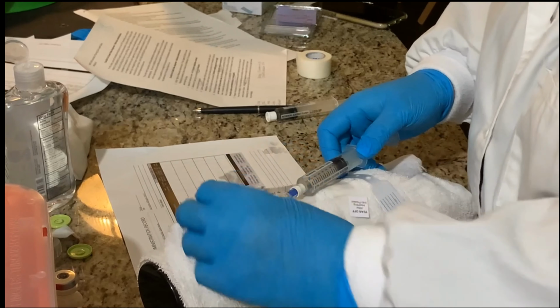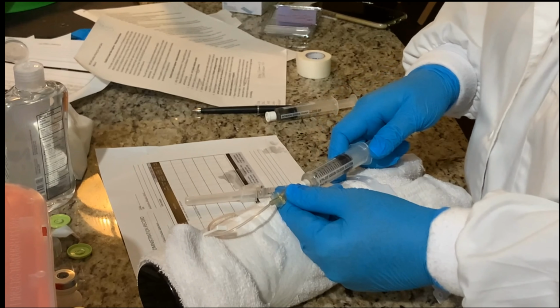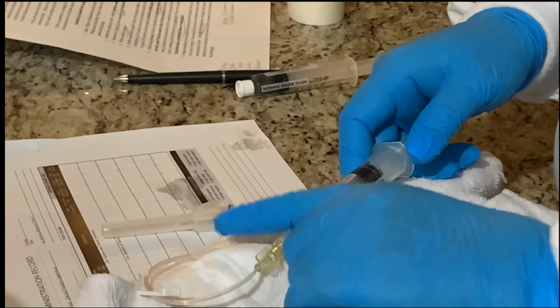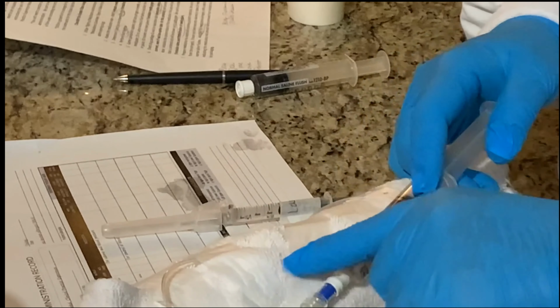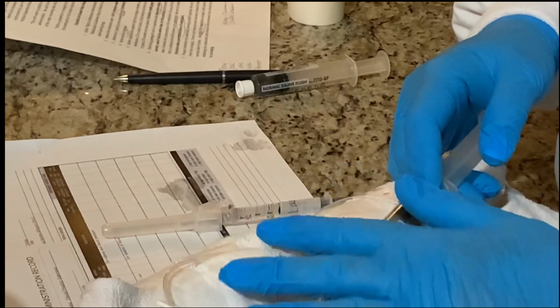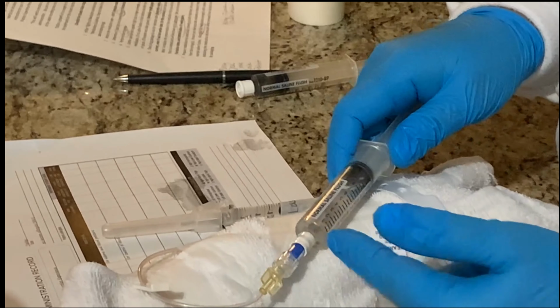Okay, so I've unclamped it. And now I'm going to check for blood return. A lot of students forget this step. And why do we check for blood return? The reason is I've not only inspected her IV site, but I want to make sure it's in the vein. So if I push this in and it swells, it's outside the vein. So I'm pulling back to check for blood return.